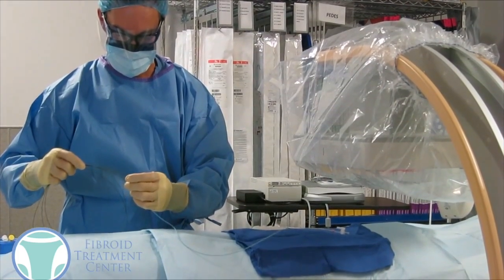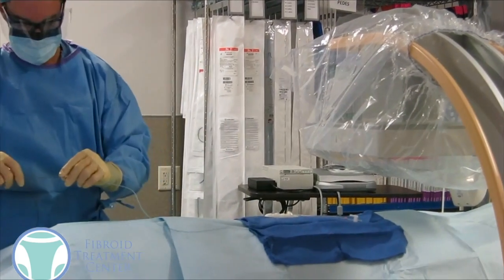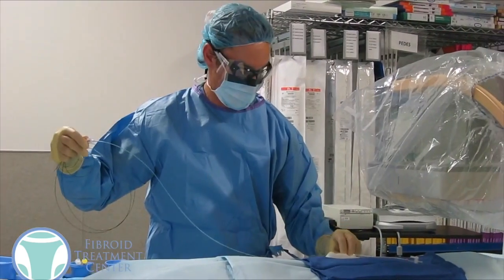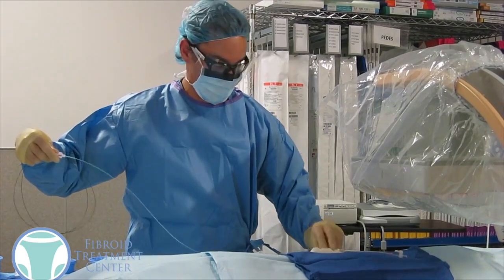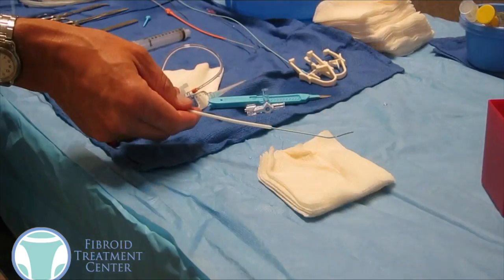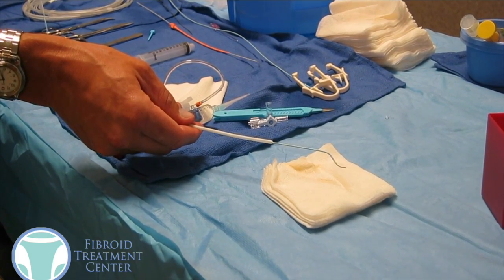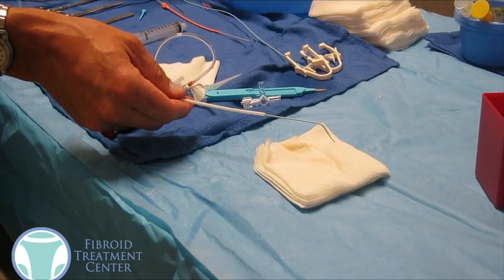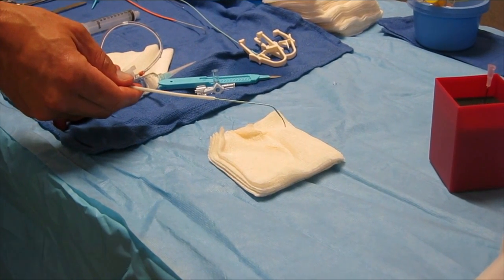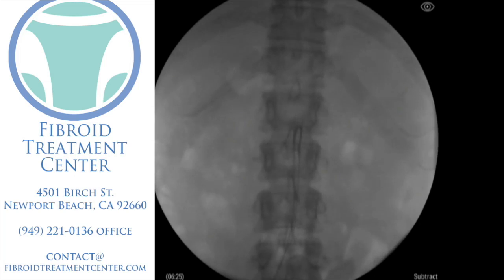Once the sedation is given, we give local anesthetic there in the groin. We put a small IV or a sheath into the artery that's in the groin. We'll feed a catheter and a wire into the artery, and as one of our other videos pointed out, we can actually control that catheter and that wire — we can spin the catheter and spin the wire to get almost 360-degree range of motion on the catheter.